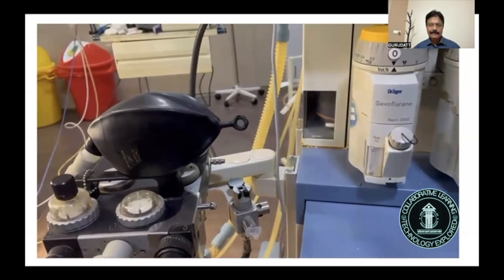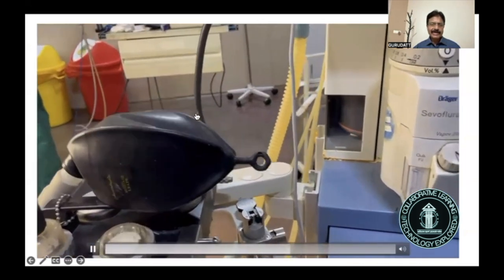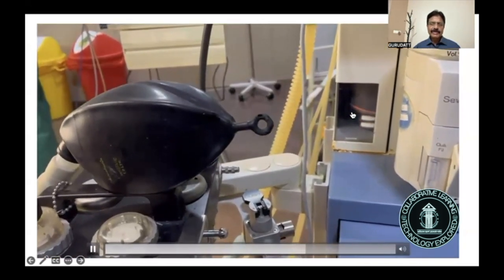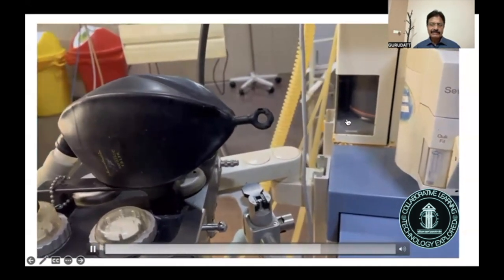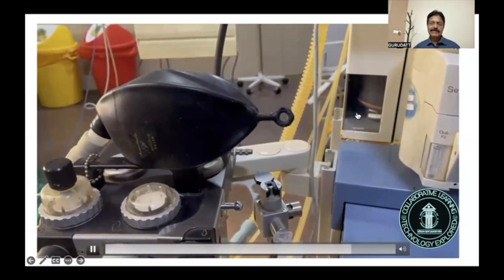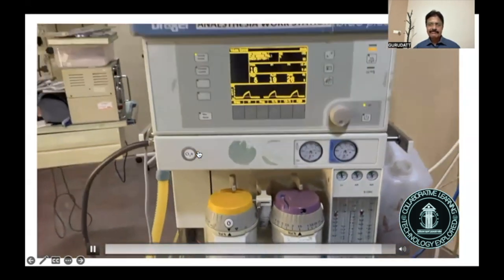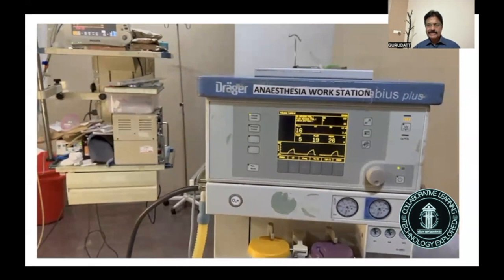So this is the piston driven ventilator. As the piston is moving down, the bag is deflating, and as the piston is moving up, the bag is inflating. That means the piston moving up is the inspiratory phase, and moving down is the expiratory phase. That is the movement of the bag. So the bag is continuously moving in this workstation when you have chosen controlled mechanical ventilation, and you know that there is a fresh gas flow decoupling valve present.